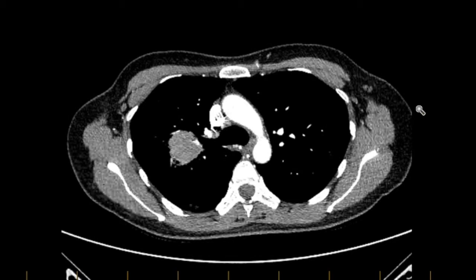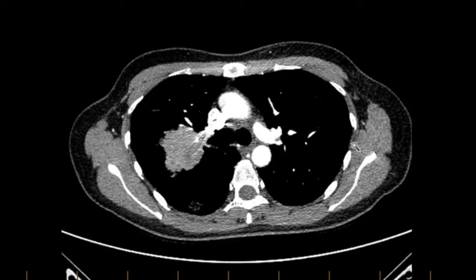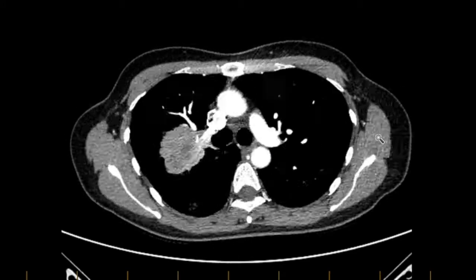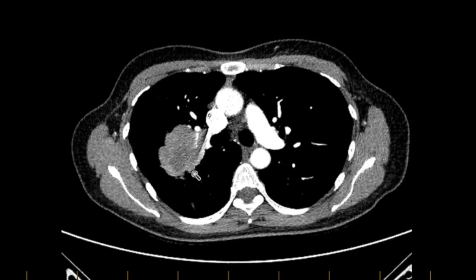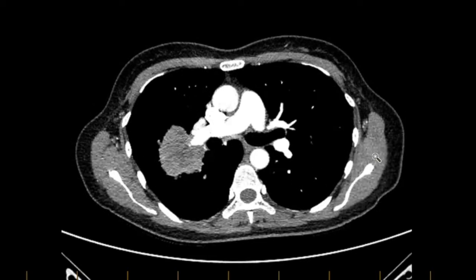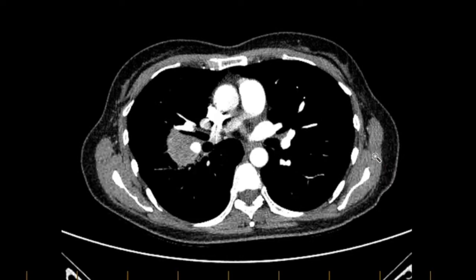If you go down further, there's no other lymph nodes in the lower right paratracheal, and there's certainly no lymph nodes in the left paratracheal station. Once again, we can see the mass here, which is heterogeneous, lobulated, with some spiculated edges.